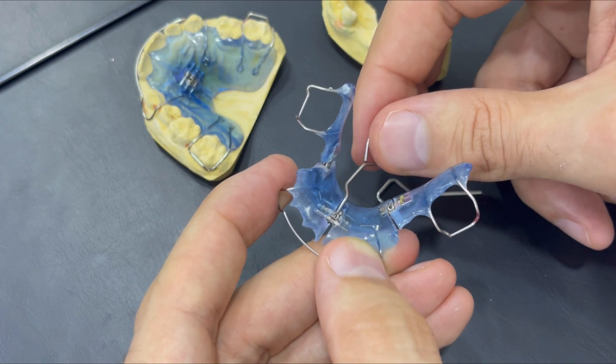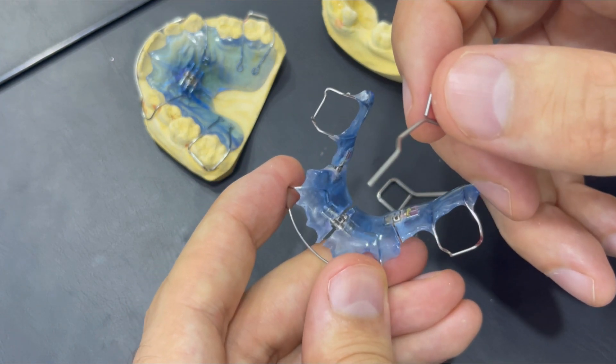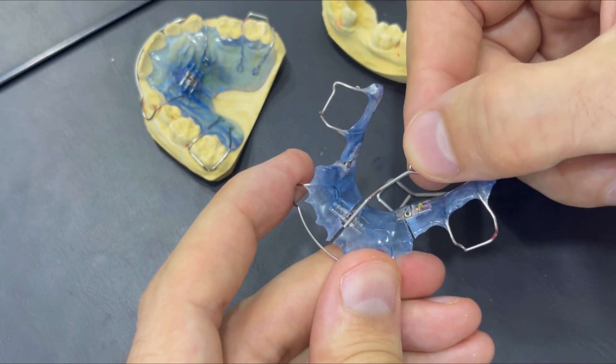Let's make this split more obvious. Now we have around one millimeter here.